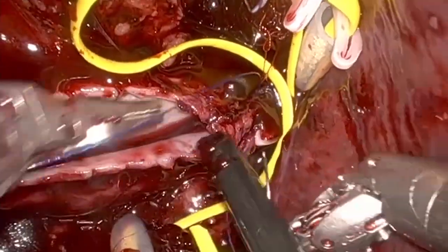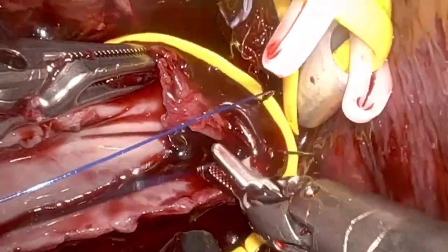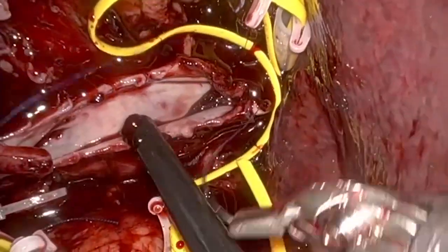The vascular continuity is reconstructed with two running hemisutures of non-absorbable monofilament.